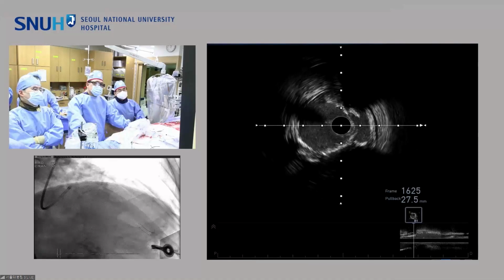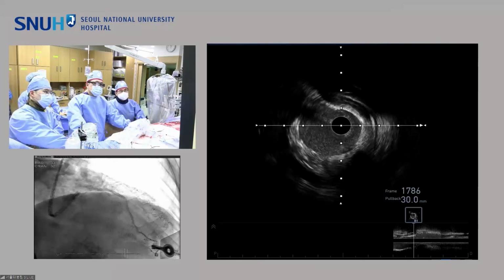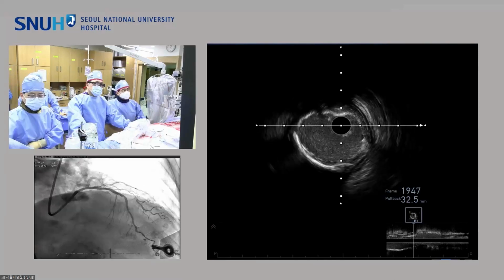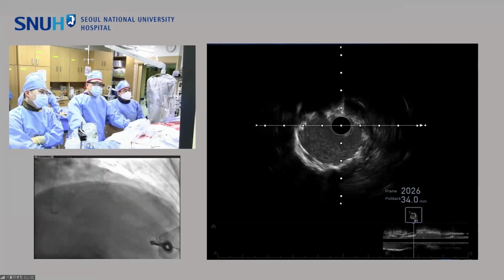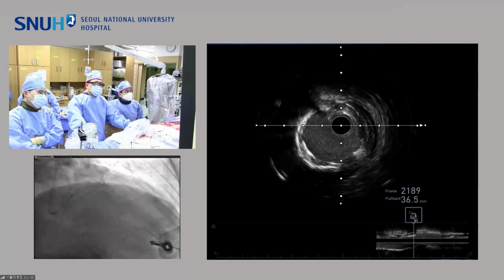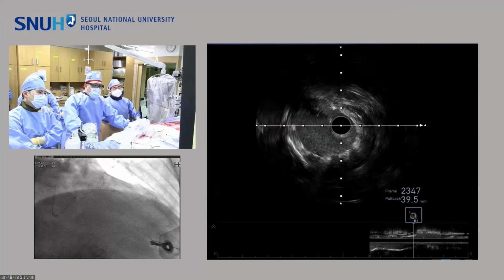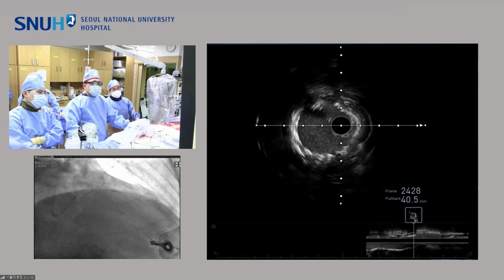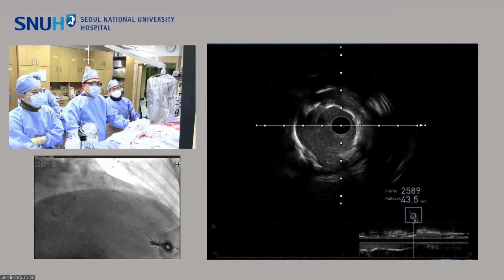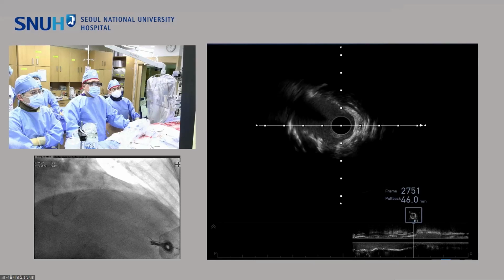Where are you now? We just passed the severe calcified focus. I see now. Just mid portion, yeah. MLD is at least 3 or more. We raised the pressure up to 24 atmosphere with AccuForce ANC balloon.